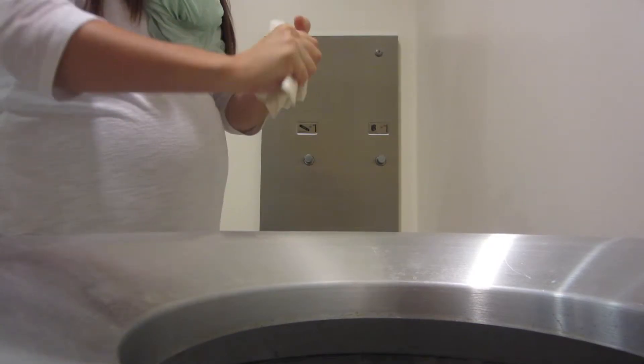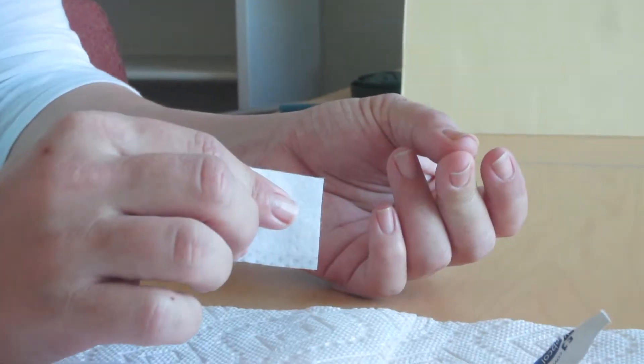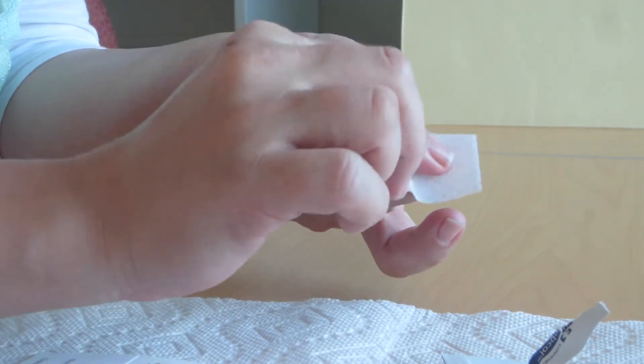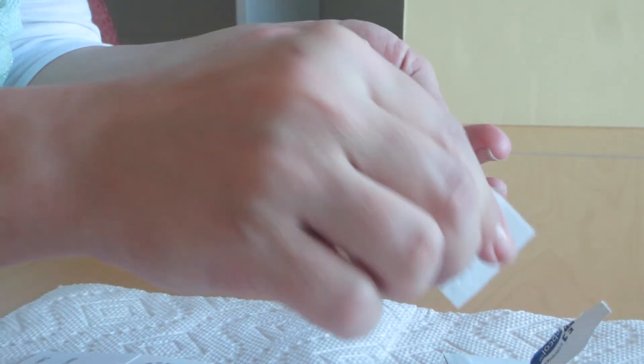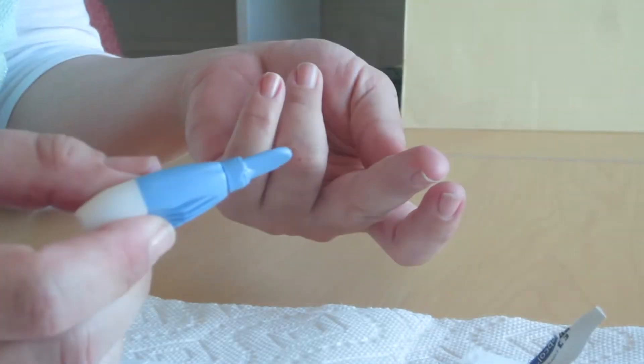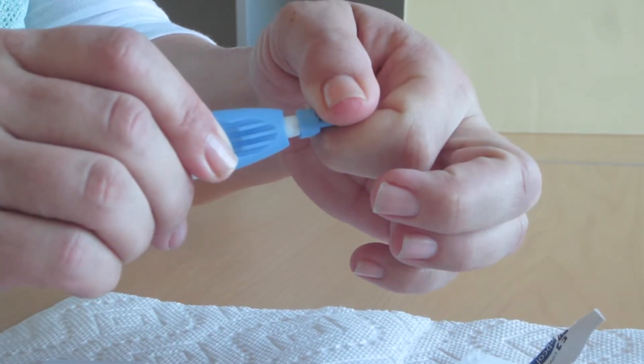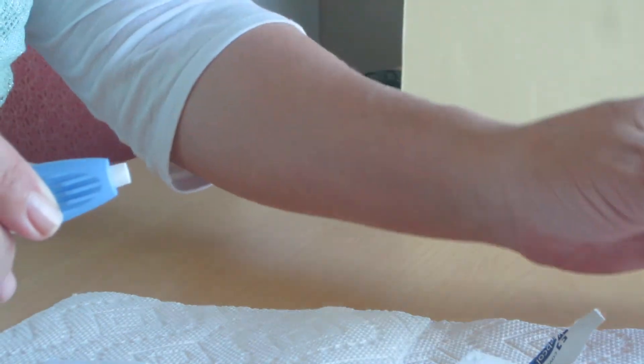Now, to begin the collection of your sample, wipe the inner fleshy side of your middle or ring finger of your non-dominant hand with the alcohol pad. Pick up the lancet and remove the cap by twisting the cap one full turn and pull until the cap comes off.